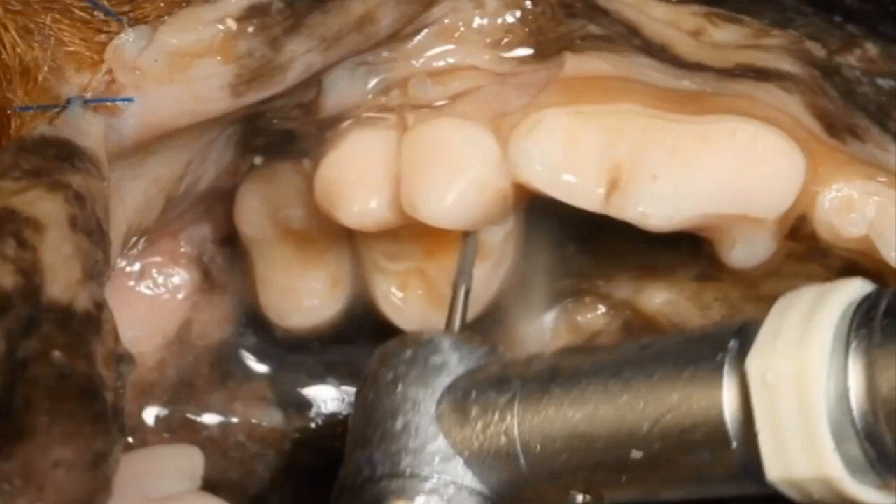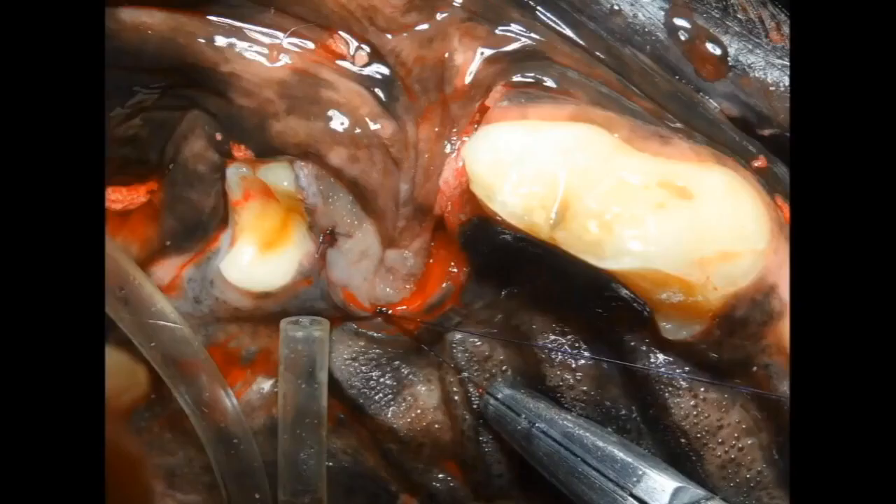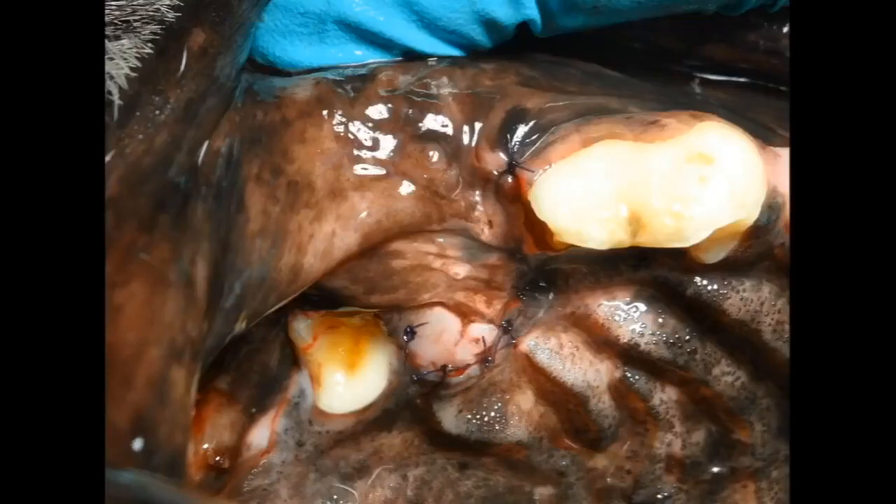That's the position you'd be in during that portion of the extraction, and we pretty much maintain it during luxation and elevation. When we close, we're in that same orientation where the crown of the fourth premolar is pointing right at us and the palate is pointing right at us, giving us really good visualization to close the extraction site.